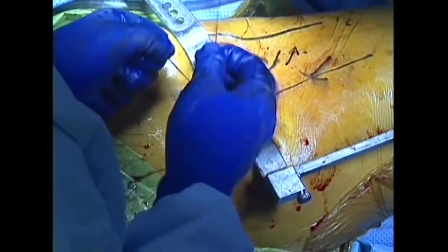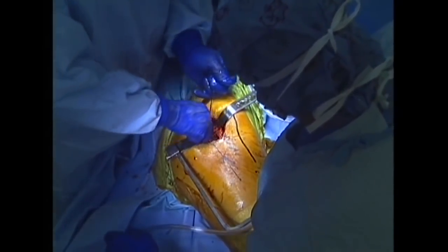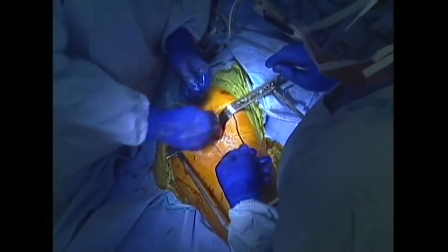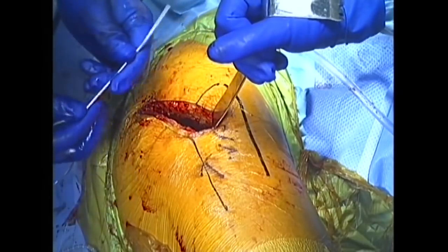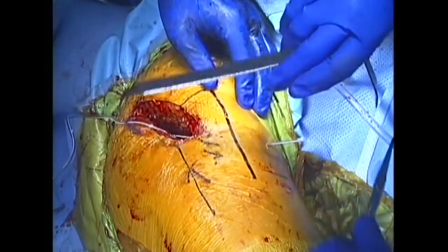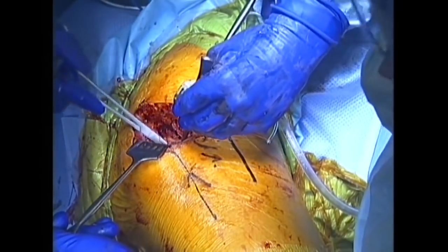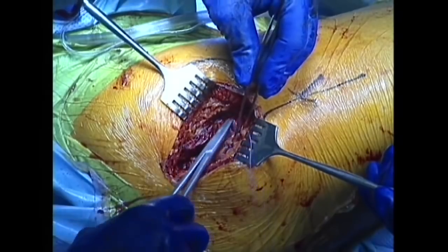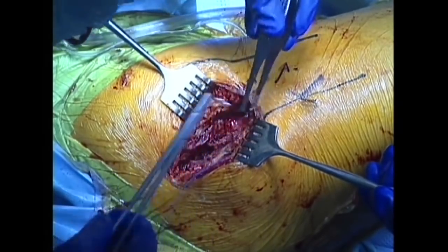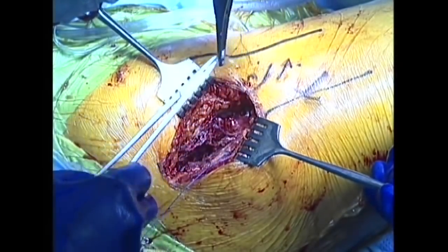A closure is performed of all soft tissue layers, beginning with the hip capsule. A removable drain tube is placed to drain postoperative bleeding. The remainder of the tissue layers are meticulously closed, sterile dressings are placed, and the patient will wake up and be transferred out of the operating room for recovery.